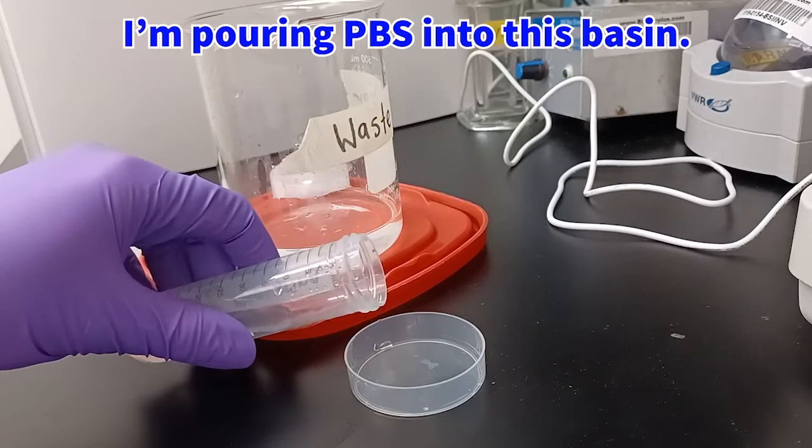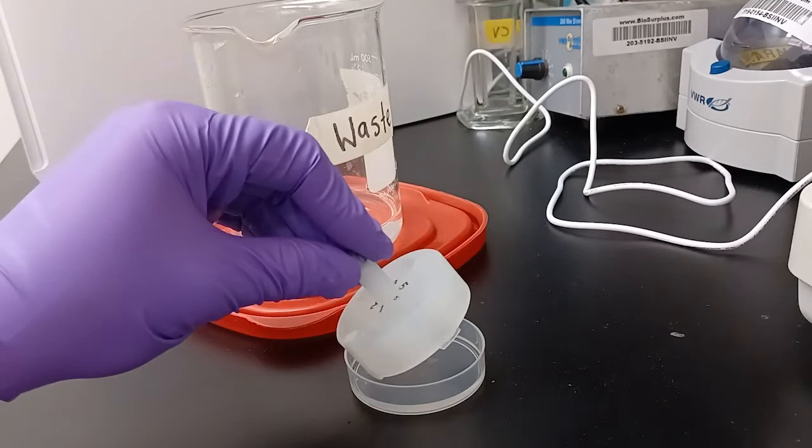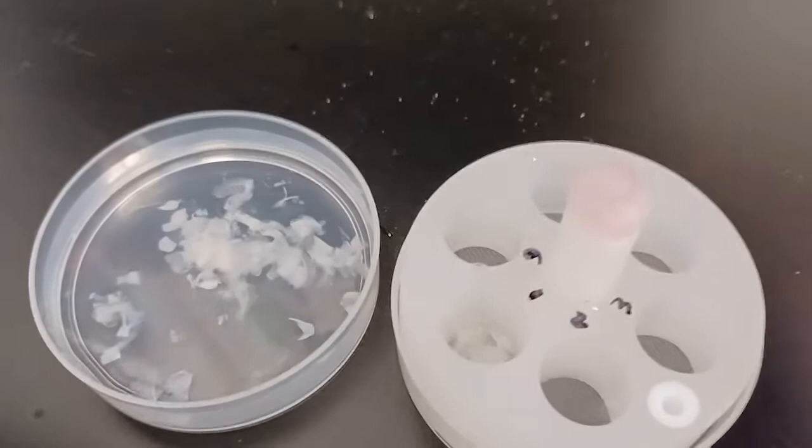After prepping the netwell, retrieve another basin that the netwell will fit into, and pour PBS solution into it. Then carefully insert the netwell down at an angle to avoid having air bubbles go up through the net.